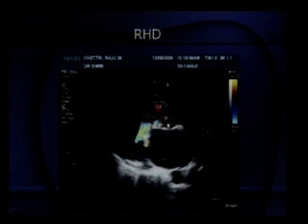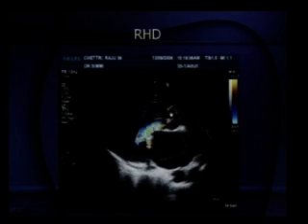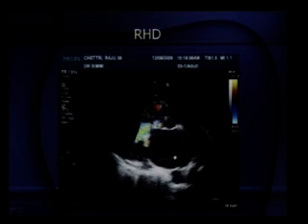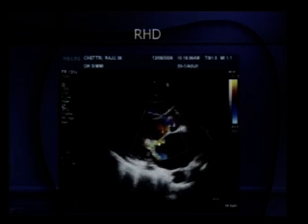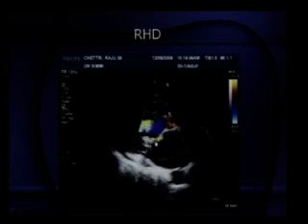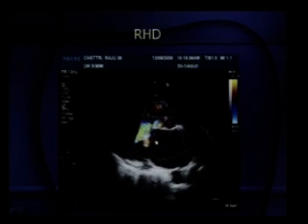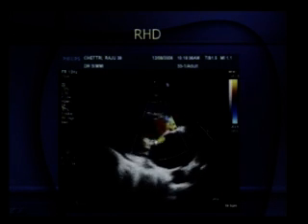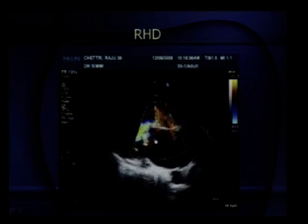Aortic valve leaflets are thickened here. Aortic root size is normal, but characteristically you are seeing that the LA size is increased. So there must be mitral pathology as well, and you are seeing some bit of mitral regurgitation. So the first and commonest etiology of aortic regurgitation in our country would be rheumatic heart disease.